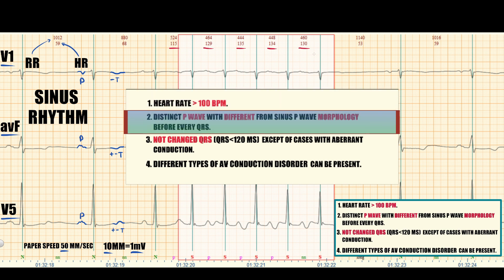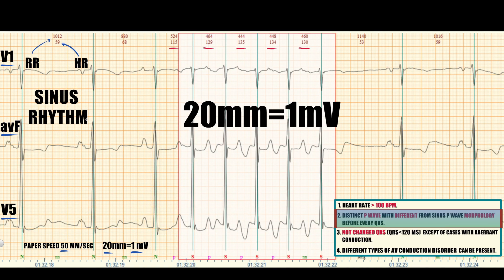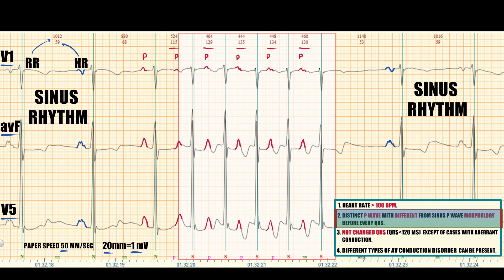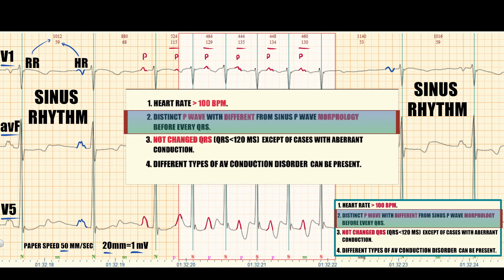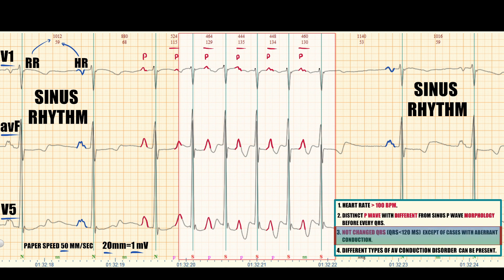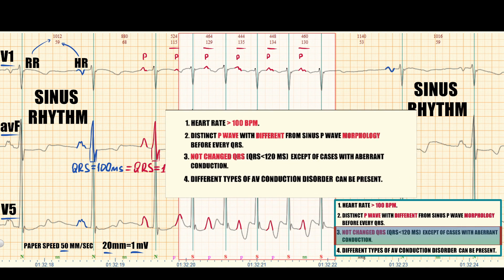After this, let's check the P-wave in this episode. For a better view, I increase the voltage to 20 mm per millivolt. In V1, the P-wave in the tachycardia episode is definitely different from the P-wave in the sinus part. The same changes can be seen in other leads. After the tachycardia episode we see restoration of sinus rhythm. So the second criterion of focal atrial tachycardia is present. Next we check the QRS complex — the QRS duration in the sinus part is 100 ms and the same QRS duration is present during the tachycardia episode, with the same morphology. So the third ECG criterion is present.